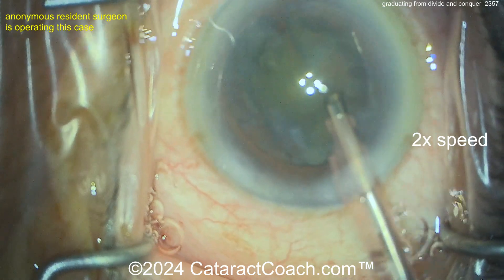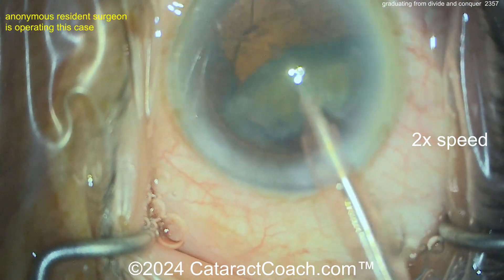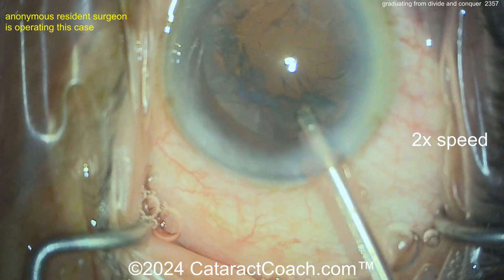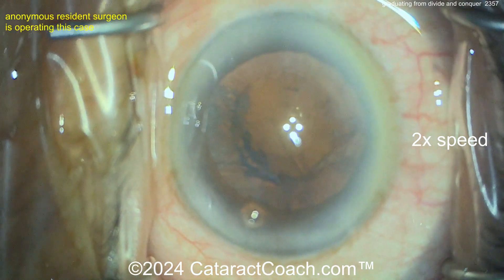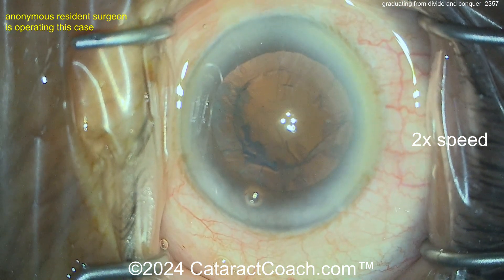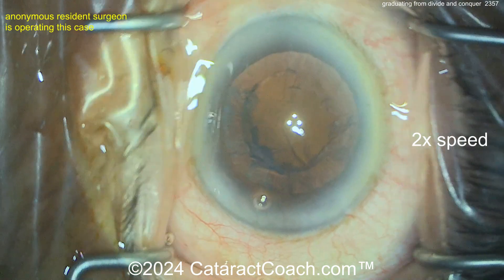Fantastic — you're doing a little bit of a stop-and-chop, maybe just getting comfortable now with faco chop. Now I made that title slide before I saw the whole video, because I like to watch the video for the first time with you — that way you get my real impressions.